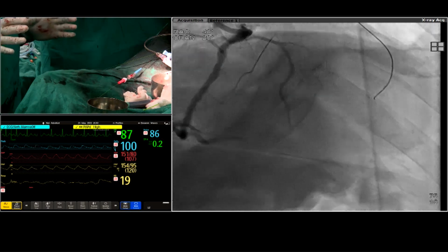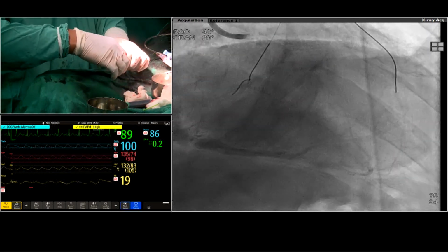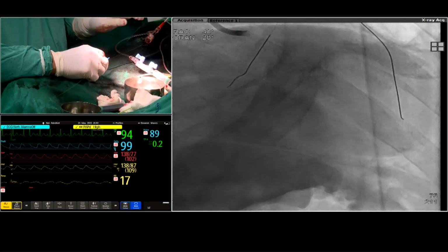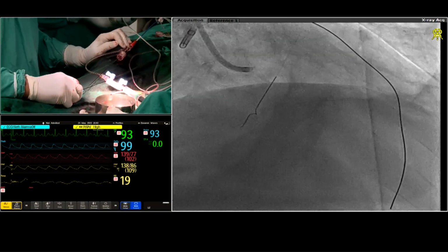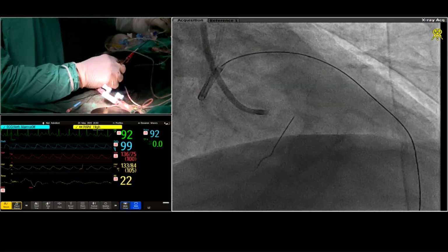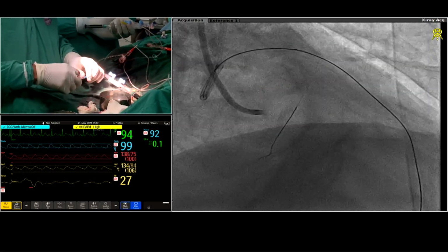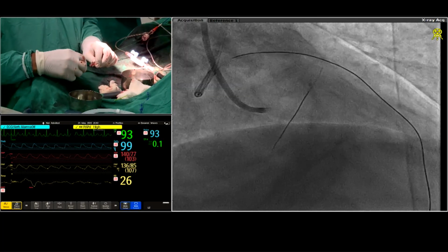I think you've done it. So we tried everything. So now with this here, this is a crusade. Just hold on. Where is it? Unlock karo. Okay, just hold on. We should not lose anything. Okay. So now this wire stays where it is. I'll get that back.